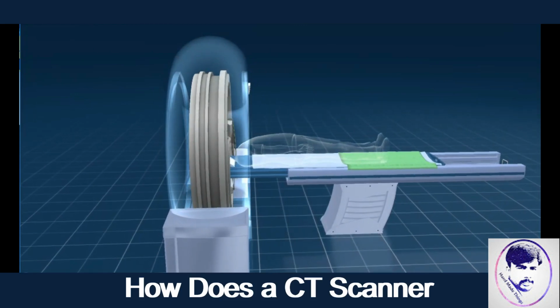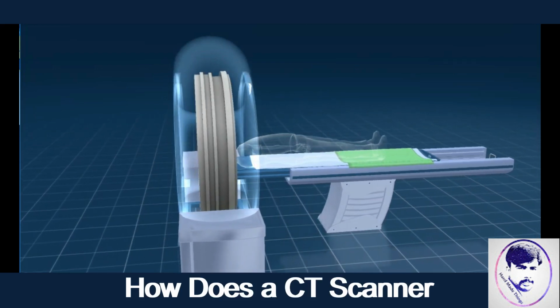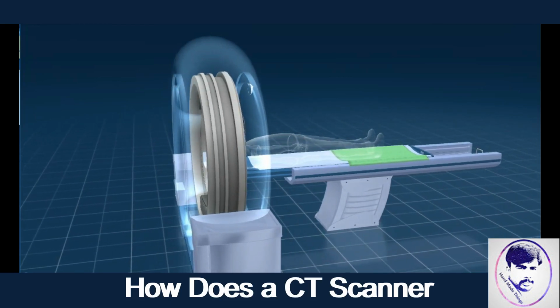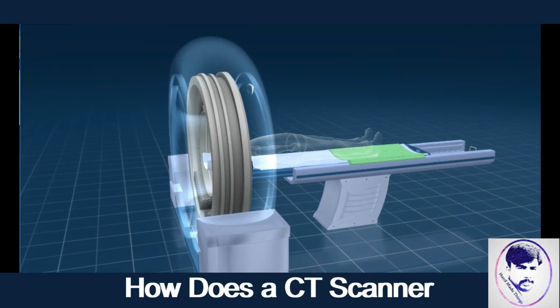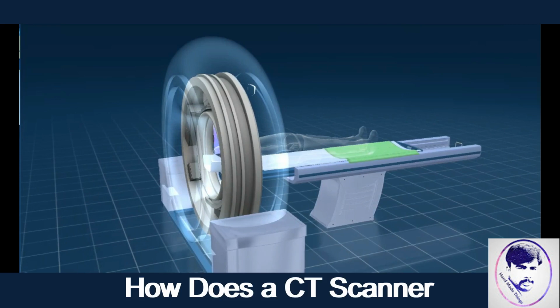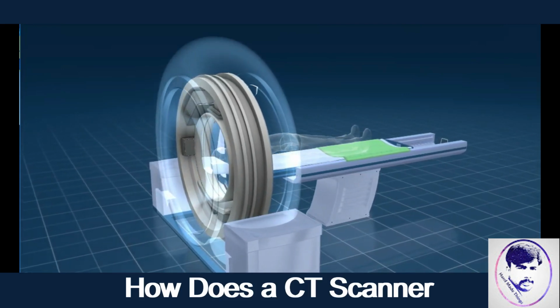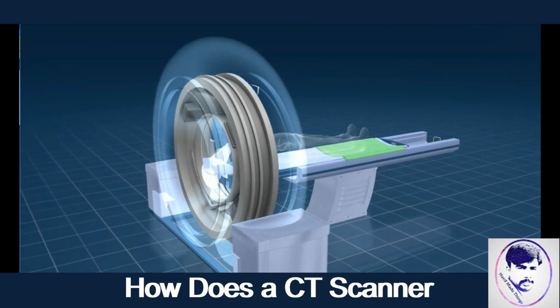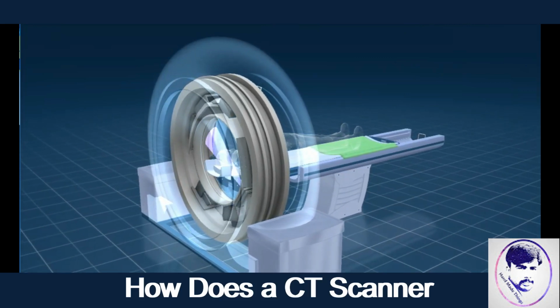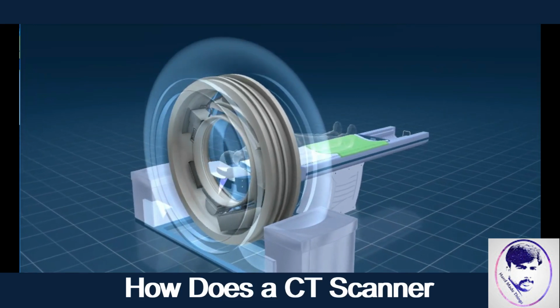How much radiation is a patient exposed to during a CT examination? The average natural background radiation on the Earth is about 3 millisieverts per year, originating from cosmic rays and the decay of radioactive materials found in the soil and rocks. A head CT exposes the body to a radiation dose of 2 millisieverts, while chest, abdominal and spinal CT scans expose the body to 7, 8, and 6 millisieverts of radiation, respectively. Due to the relatively high radiation exposure, this diagnostic method is recommended only in medically justified cases.